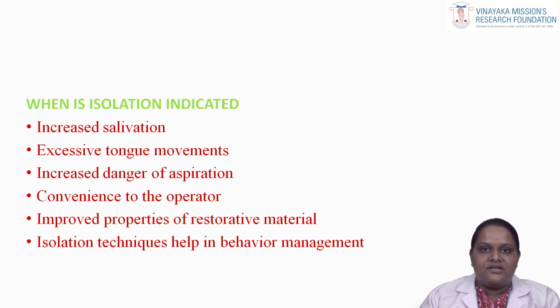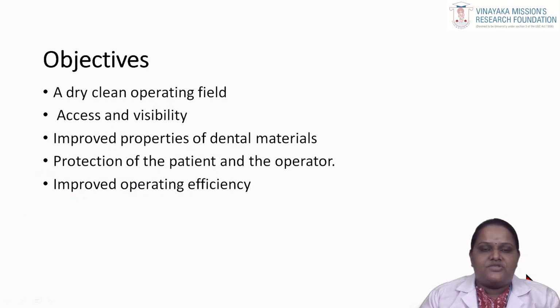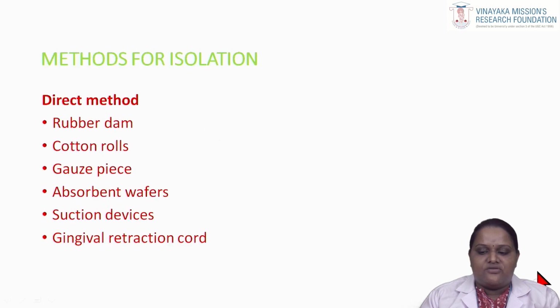Convenience of the operator. Thus, it increases the operating efficiency of the dentist. Improved properties of the restorative material. Isolation techniques also help in behavior management. So, what is the main objective of this? A dry, clean operating field. Access and visibility is improved. Improved properties of the restorative material. Protection of the patient and the operator. Thus, it prevents cross-infection and improves the operating efficiency of the dentist.